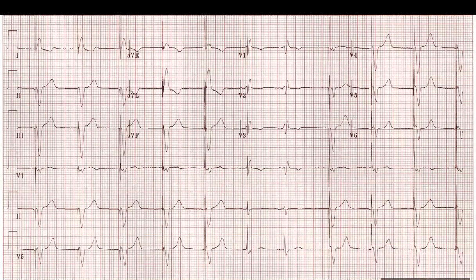The next question: is this a single or a dual? Single. Why not dual? I don't see any pacing before the atria, before the beat. Exactly. So if we have some sinus node activity here, that means this is not atrial fibrillation, but the device should be able to pace the atrium before it paces the ventricle, right? And you don't see that evidence over here.